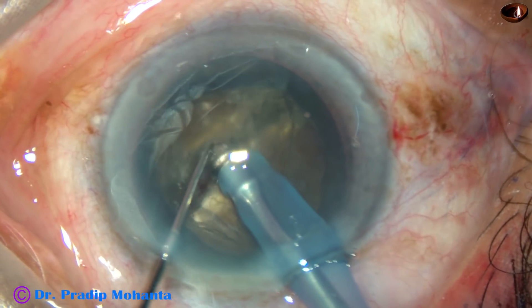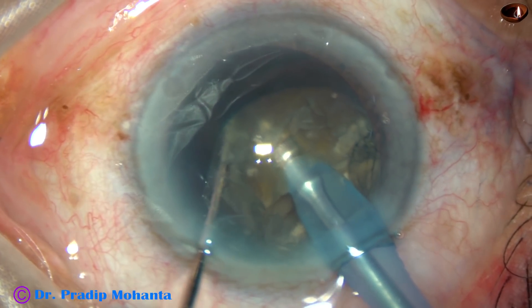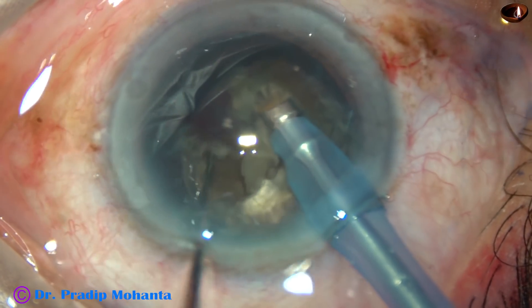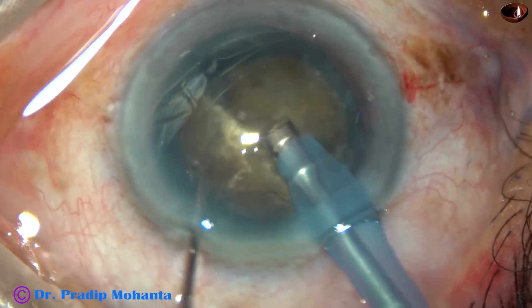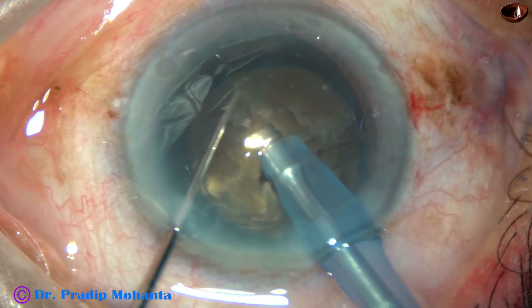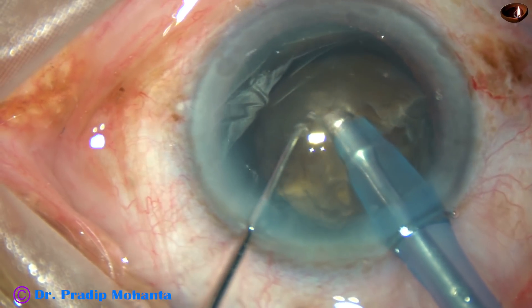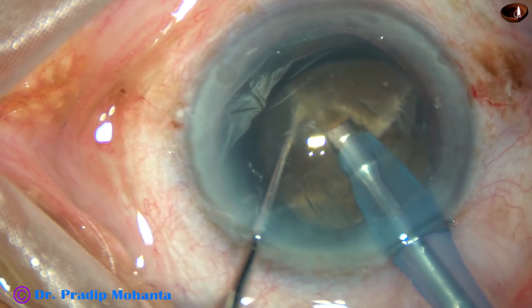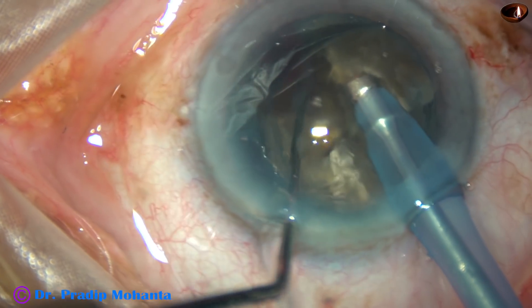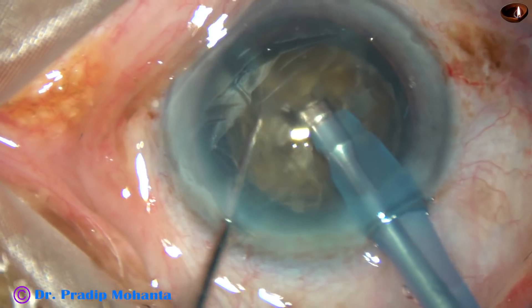Rotate 180 degrees and separate the nucleus completely. Now, this hemi-nucleus is divided in the same way. It has been divided into two large pieces. And now the other hemi-nucleus is divided into two large fragments. So the hard nucleus has been divided into four large fragments.